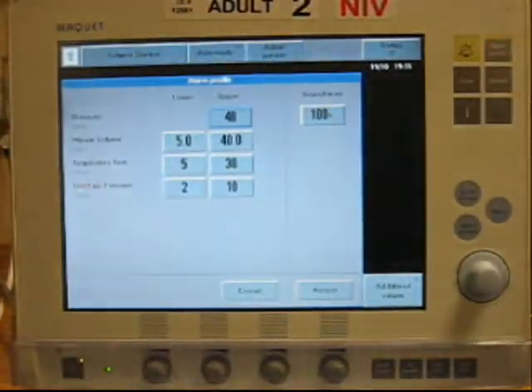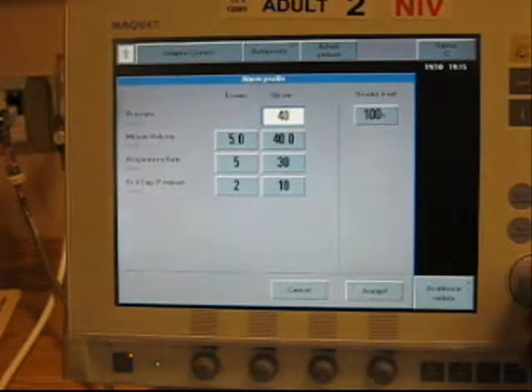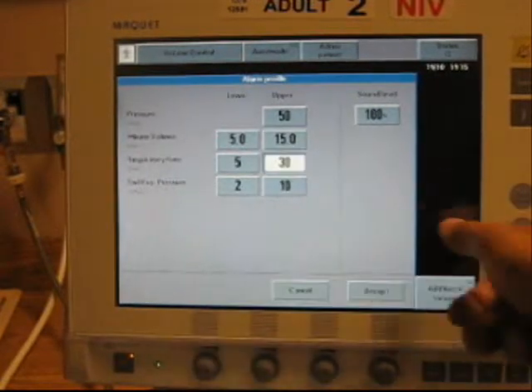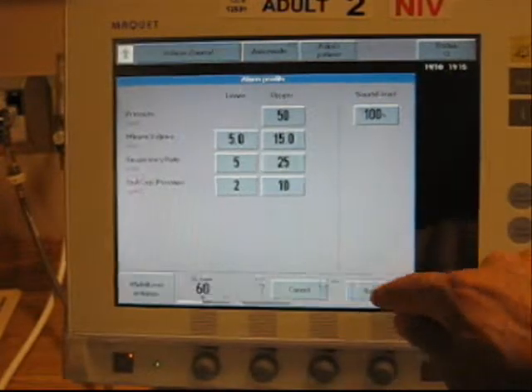Alarms on mechanical ventilators should also be set according to what's available and the capabilities of the individual machine. All alarms should be set at reasonable values, with simple guidelines of high pressure limit of 50 centimeters of water, low inspiratory pressure where available halfway between baseline and peak inspiratory pressure, and low tidal volume alarms approximately 15% below what's anticipated.